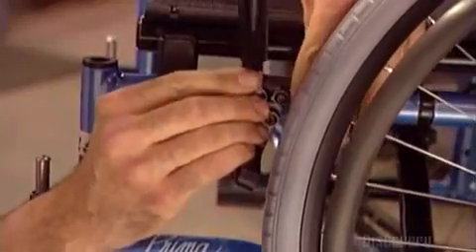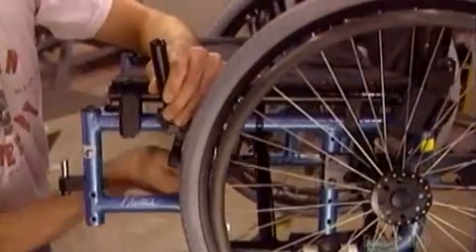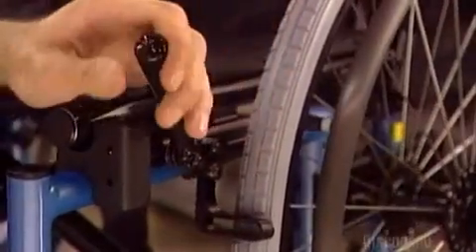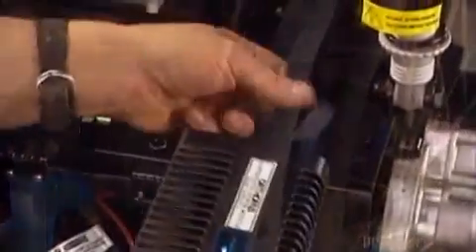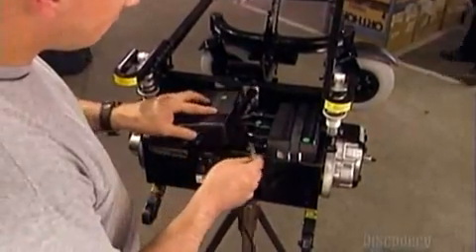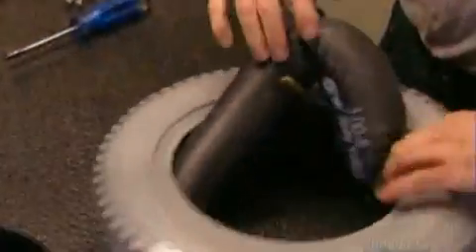This plastic and aluminum hand lever is a parking brake. It keeps the chair still when transferring to a bed or toilet. This motorized chair has an electrical controller. The user commands it with a joystick. The chair runs on 2 12-volt batteries that power up in 8 hours from a household socket.